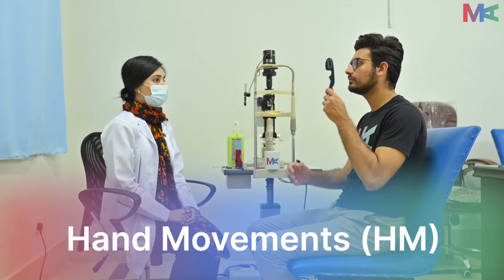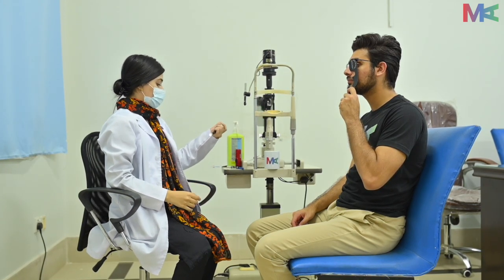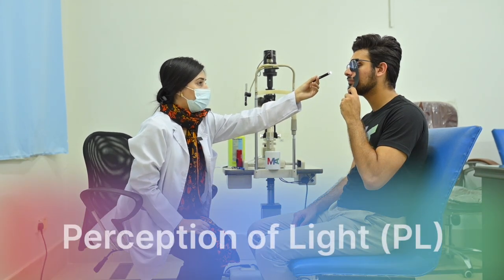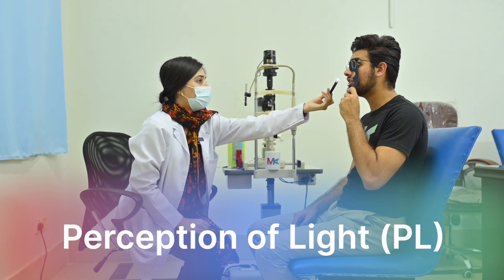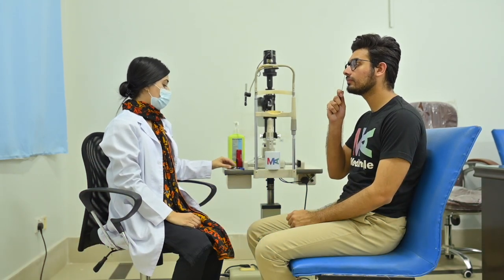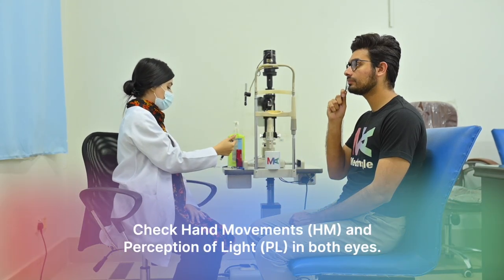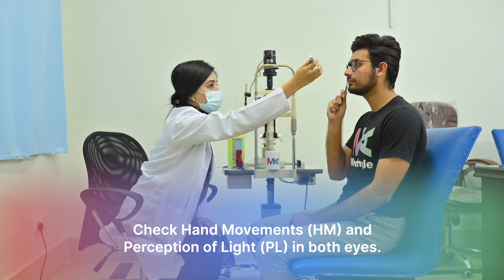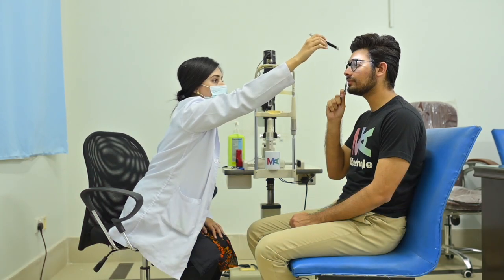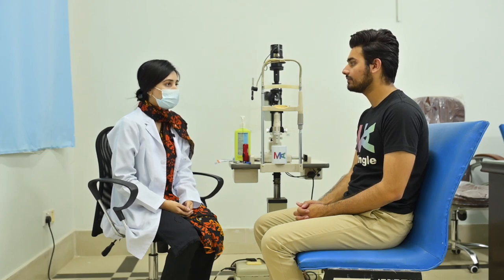Waapas se ulti aank pe rakhein. Aap ko mera haath hilta hua mehsoos ho raha hai? Bilkul ho raha hai. Aap ko roshni mehsoos ho rahi hai? Theek hai, bilkul ho raha hai.